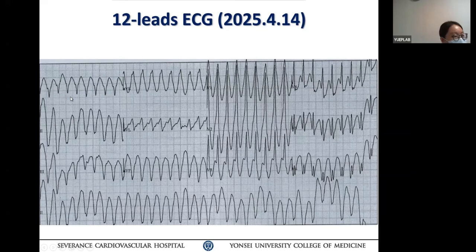So, is it possibly the patient has a double tachycardia? In other words, atrial arrhythmia and the VT going on, and the atrial tachycardia so fast, able to conduct once in a while, even during the VT, causing a fusion. Quite possible, unless the patient has complete heart block, which is unlikely, right? So those are things that we need to discuss. So when you read ECG, take a look at it.